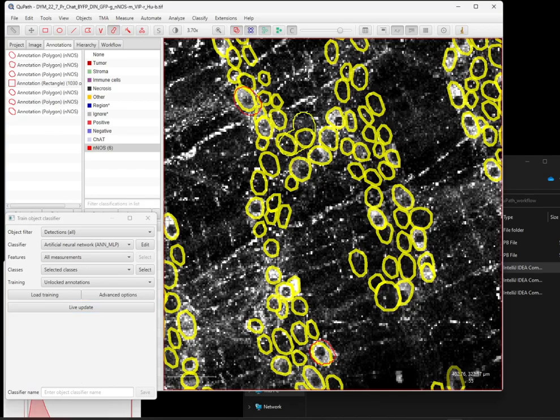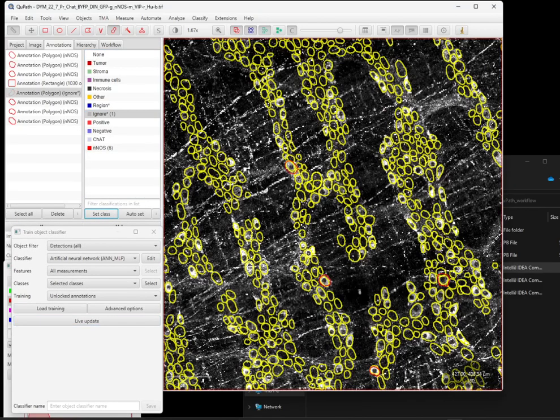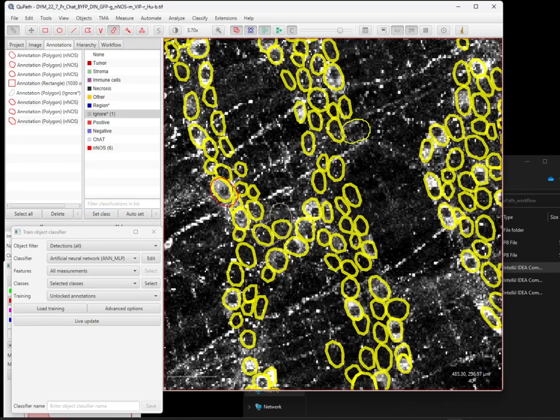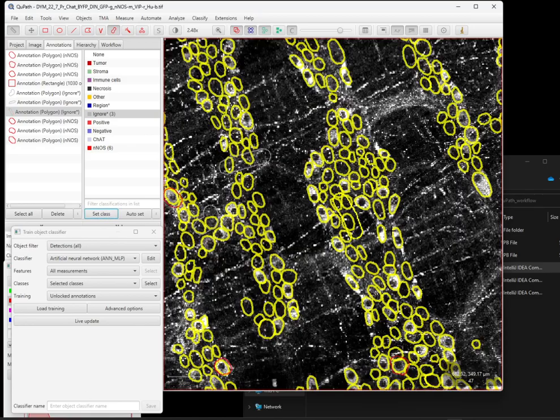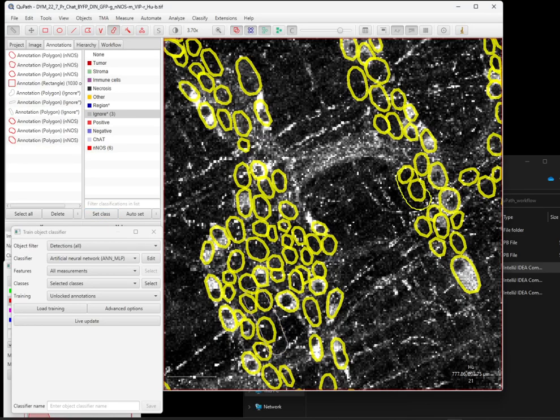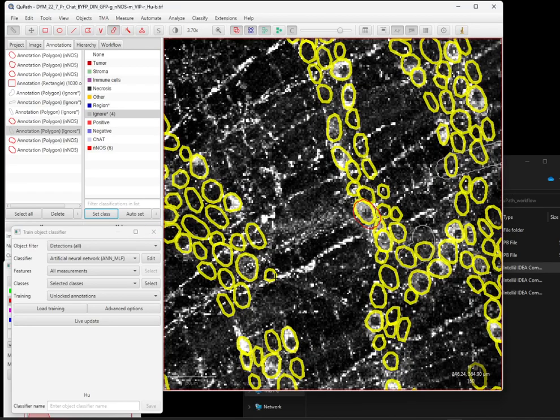We can go and say, hey, these stuff here, just set as ignore class. Like they're not anything of interest. I'll do a few more of that. I think where there's some really nice fibers running through cells, yeah, this will be a good one.